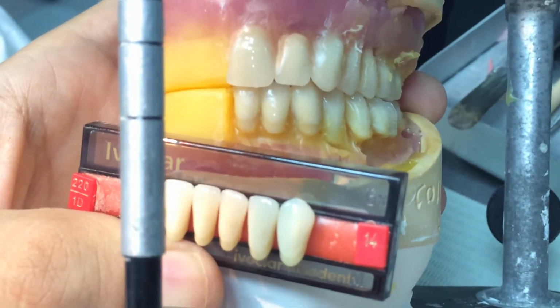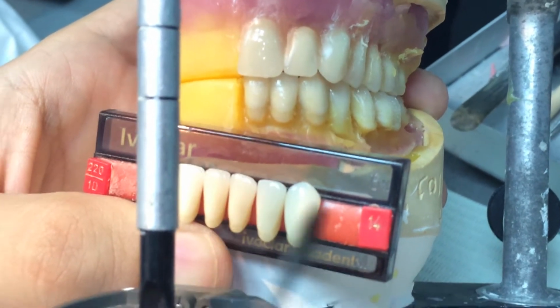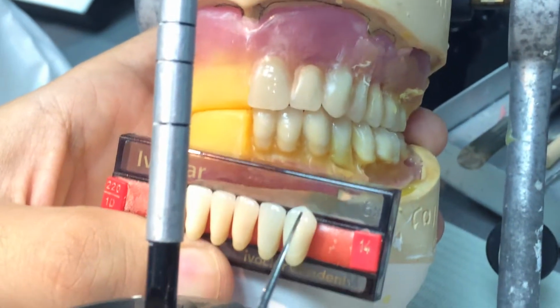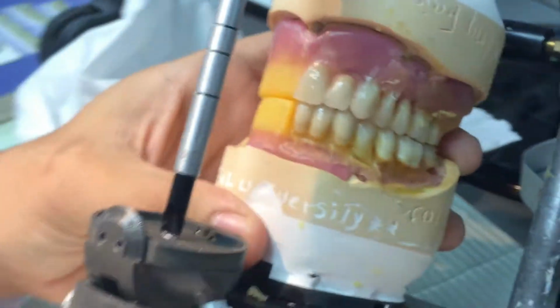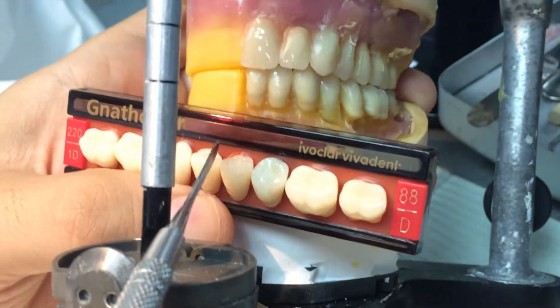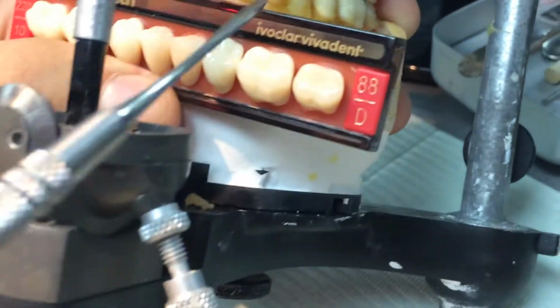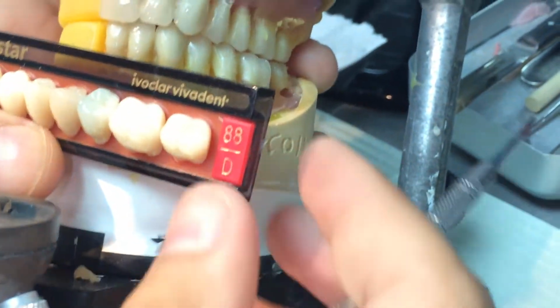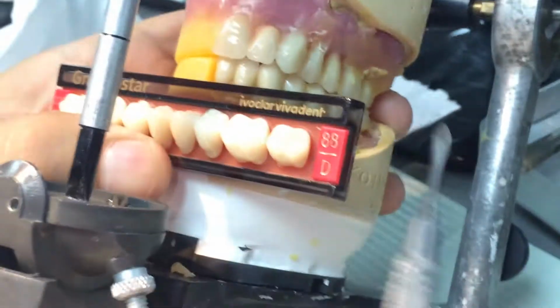Clear? We don't bring the patient's right and left into it, because that would make it a little confusing. Just to make it easy for the set itself, you're going to put it on the same side. How about posterior teeth? Same thing. Let's say this side, which is my right, is going to be my right on the articulator also. This side goes here.